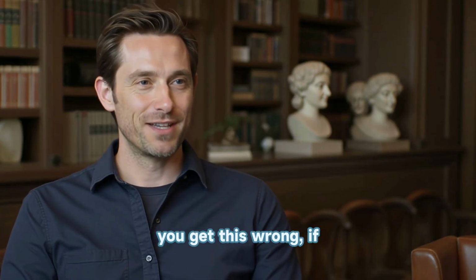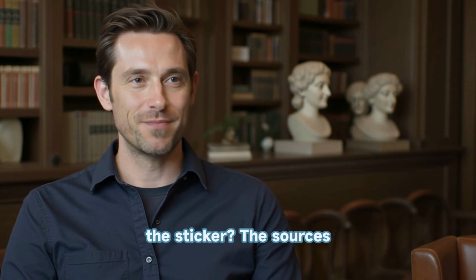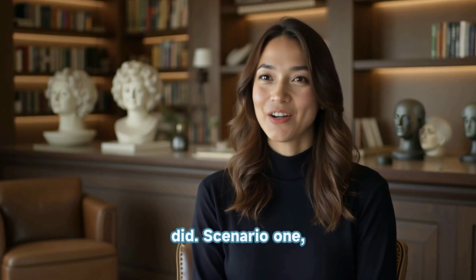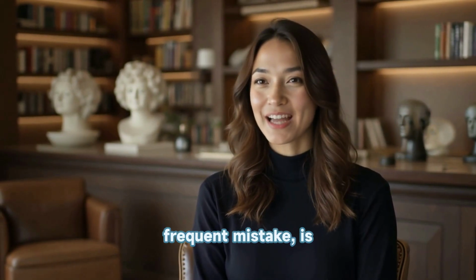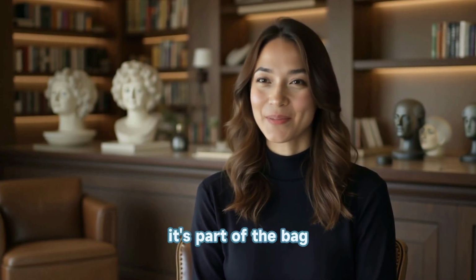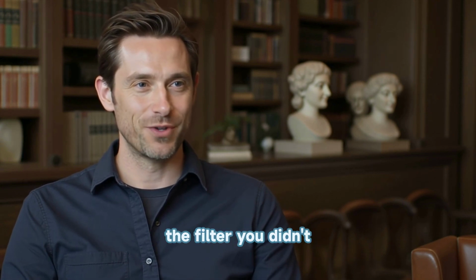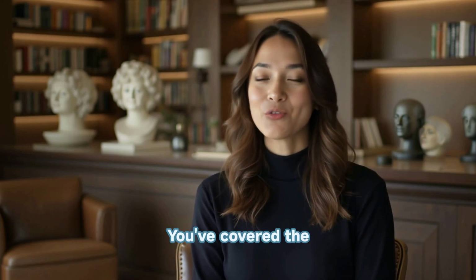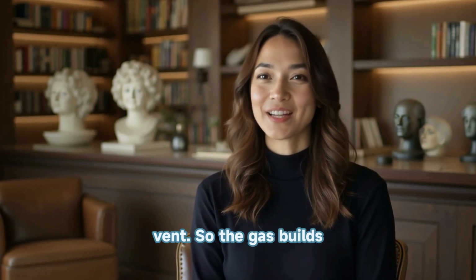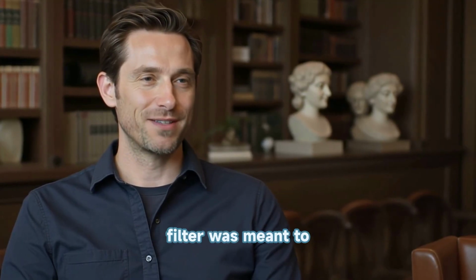Okay, so what happens if you get this wrong? If you, say, misunderstand the sticker? The sources mentioned a couple of common pitfalls. They did. Scenario 1, probably the most frequent mistake, is just leaving that sticker on all the time. Maybe thinking it's part of the bag or just forgetting about it. Oh, right. So you've effectively just disabled the filter you didn't even know you had, maybe. Exactly. You've covered the vent. So the gas builds up, it has nowhere to go. And you get ballooning. The very problem the filter was meant to solve. You got it. Leads straight back to ballooning.